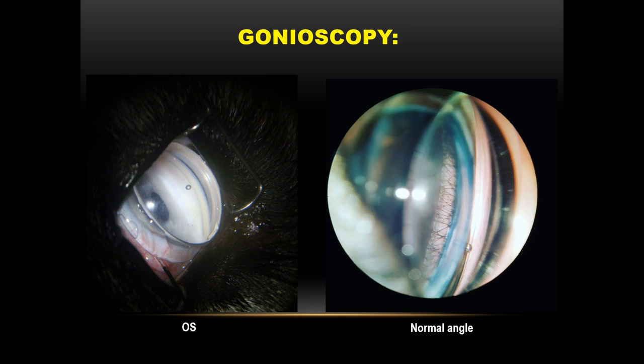So the angle is not normal, just like you see here in this other picture, okay? You don't have this drain-like appearance. So there is no normal angle here, just a couple of holes to drain the aqueous humor, okay? So this is the left eye.